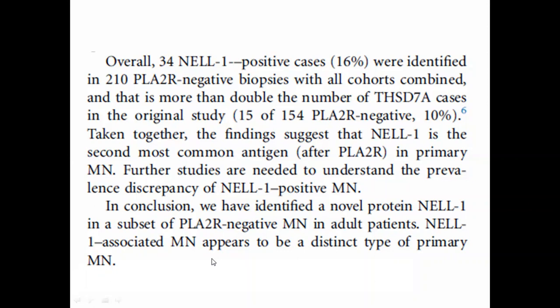So, how to measure GBM thickness? It's compared with the tubule wall thickness. Yes. So the terminology when I say GBM, that means we are talking about ultrastructure examination. Dr. Singla asked how to measure the GBM thickness. It is measured ultrastructurally on electron microscopic examination. It is not measured on routine light microscopy. Then Dr. Biswas asked, it's compared with the tubular wall thickness. Yes, it is on light microscopy.